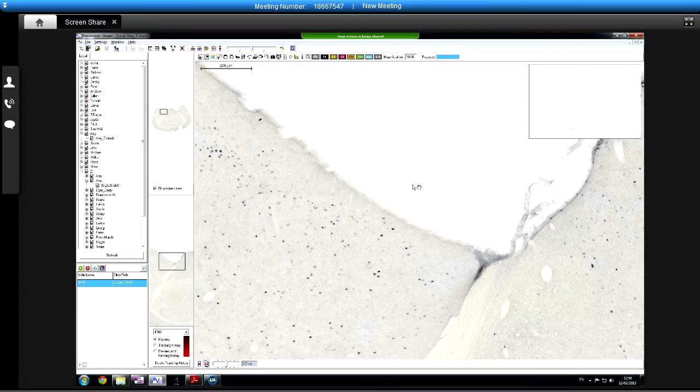especially when you reopen a slide, it doesn't show you anything. So you've got show annotations and show measurement annotations. That just shows you the measurements. Oh, there aren't any on this slide, are there? Shows you those measurements.